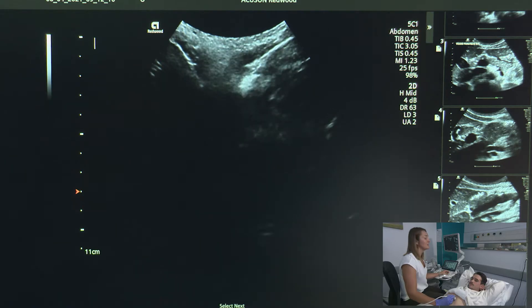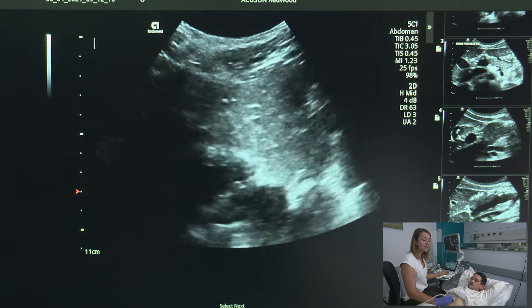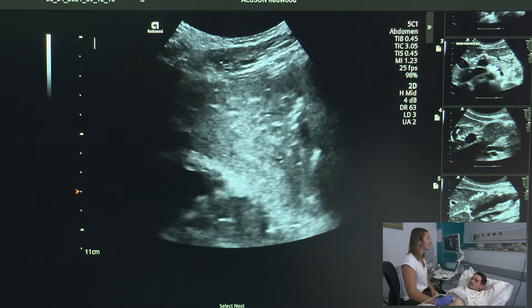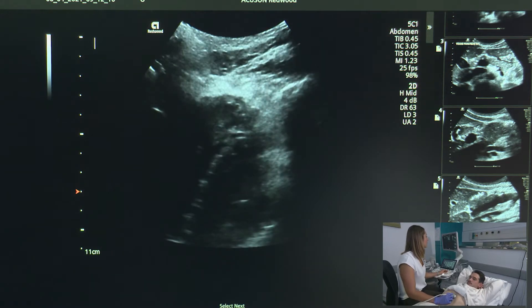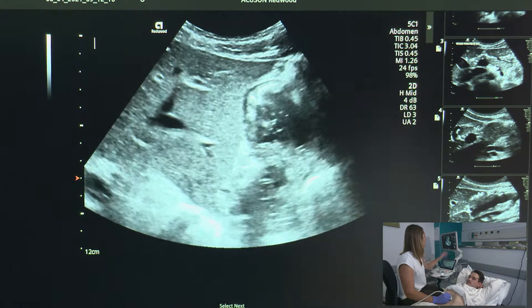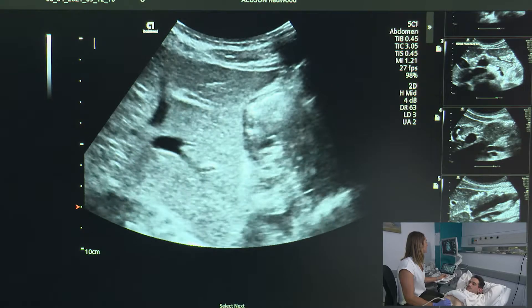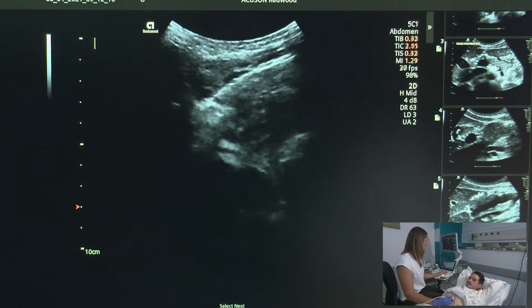My next transverse sweep of the left lobe is going to include that tip which I cut off. I'm going to angle my transducer and do that exact same sweep, just making sure I keep that tip on the entire time. Big breath in and hold it. I angle up towards the heart, come down, keep that nice tip on, change my depth, and come all the way out and back up towards the heart again. Breathe normally.